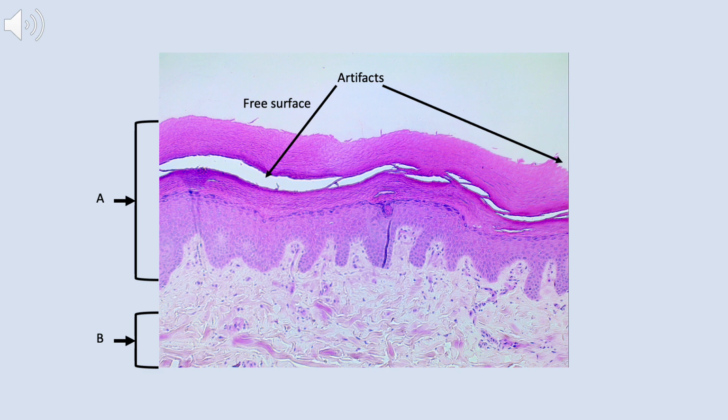So I could identify this on two factors really alone. One, just knowing that those collagen cables are routing through in a really disorganized way tells me that it's dense irregular connective tissue. The other thing is knowing that underneath our integument, underneath our skin, you will find a layer of areolar connective tissue. That's the gap between A and B. And then beneath that is always dense irregular connective tissue. So you could get that answer from either knowing the structure of the skin or identifying the collagen fibers themselves.